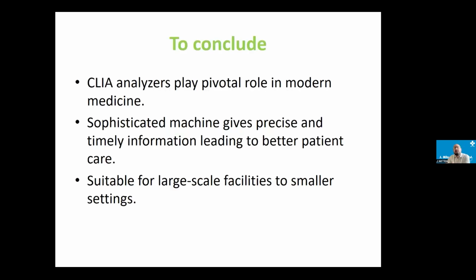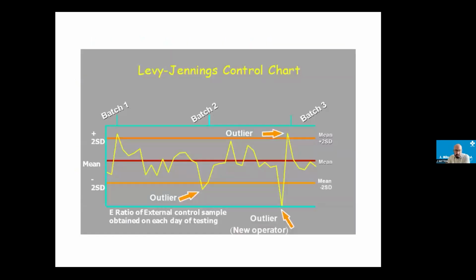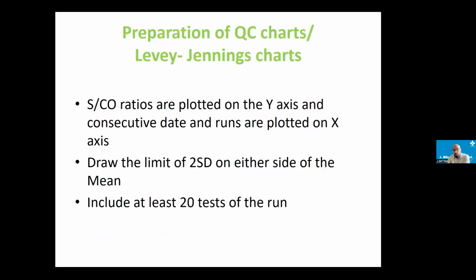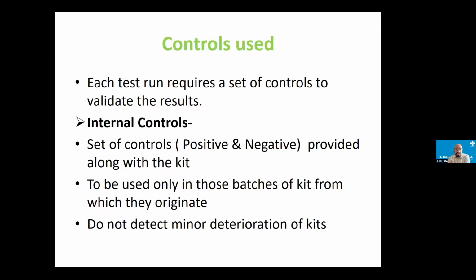There was one thing that you mentioned, sir, towards the end of your presentation, in your conclusion, which was the discussion on false positivity. Now, CLIA is known for its sensitivity, but what is the trade-off? Given your experience, what is the trade-off in terms of false positive rates, especially in low prevalence populations? How do you suggest handling donor deferral based on reactive CLIA results? Because a lot of people are getting positive results in CLIA which are not coming in rapids or ELISAs. So how should the blood center approach that?